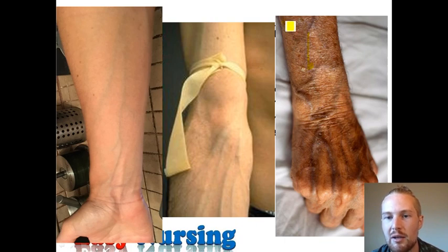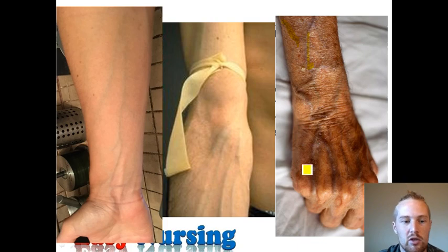If this is a vein I'm looking at here, I'd probably start it maybe here. Looks pretty straight, starting just above the bifurcation going up. So like I said, don't start anywhere before the bifurcation. Start just after and work your way up. Don't start at the bifurcation. Start just after and work your way up. So this is how I would choose where I would start an IV.